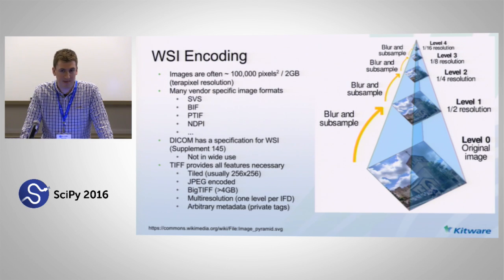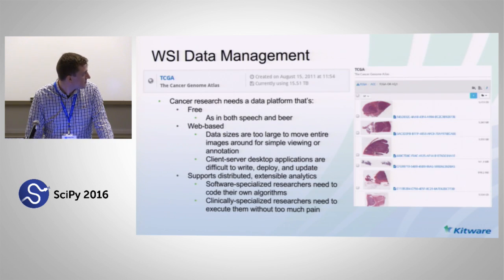Metadata is, of course, a problem, as always, if we're not using DICOM. That's something we would like to address with future efforts, but at the moment we're focused more on the analysis of the images and less on curation of the metadata.